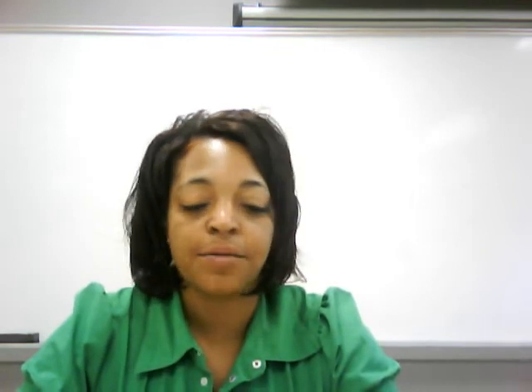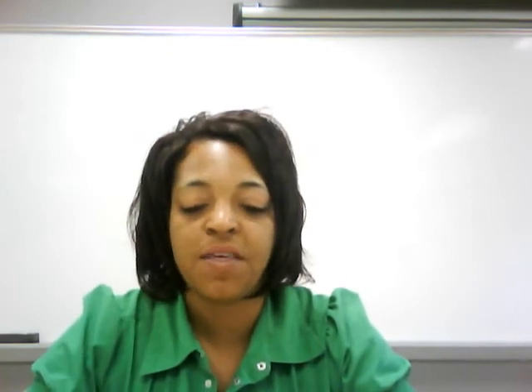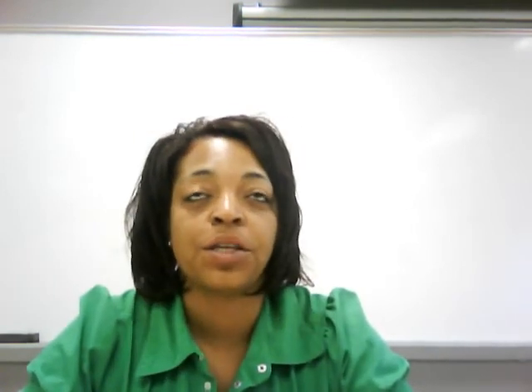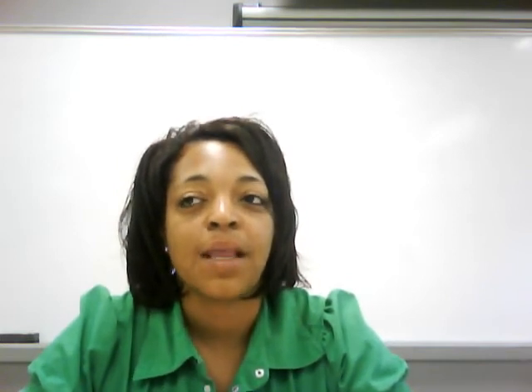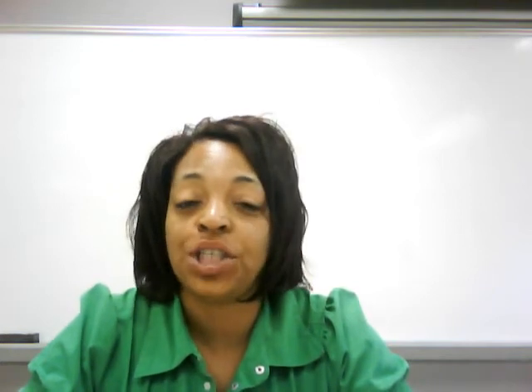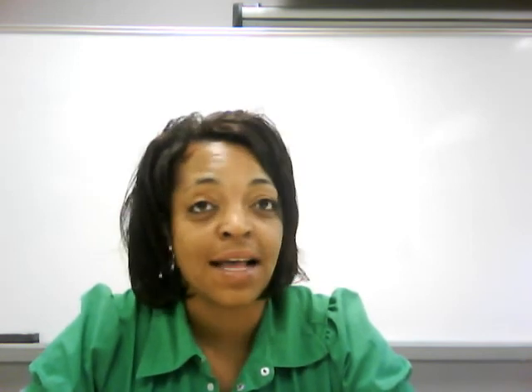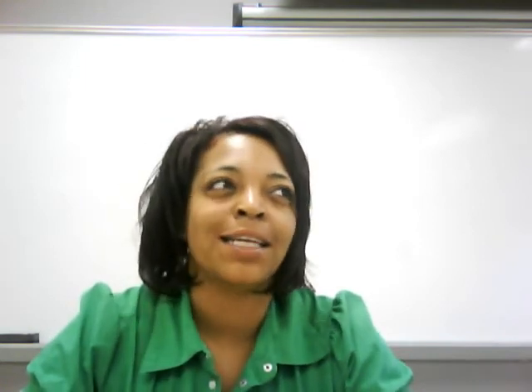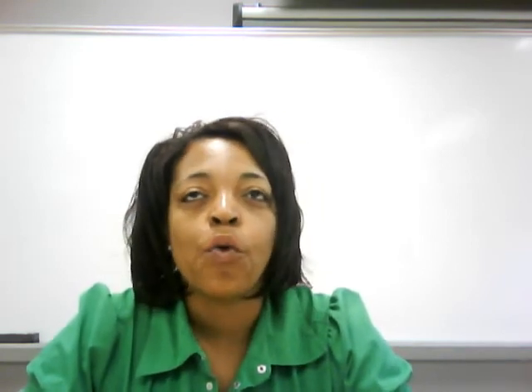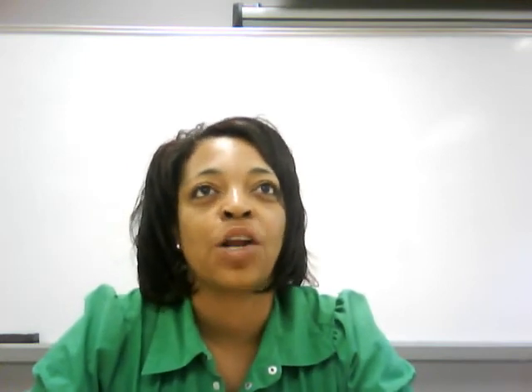Okay, now, with all that we've discussed today, what would you say would be the best way to take a picture and have it actually represent what you're trying to show? That's right. We should have a picture that shows an accurate or correct size, an accurate or correct shape, the right color or the right amount of color, which in the case of a radiograph, it won't actually be color. The colors we'll be talking about are black, white, or gray.